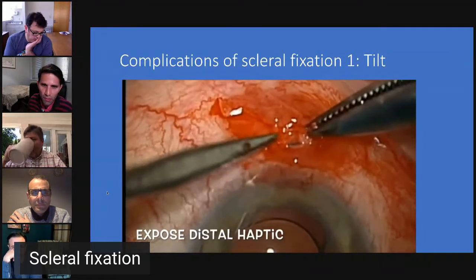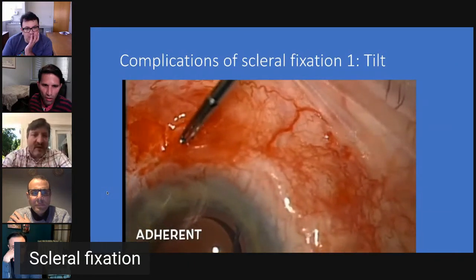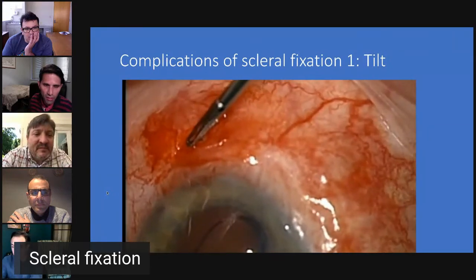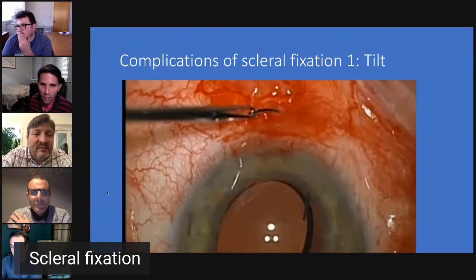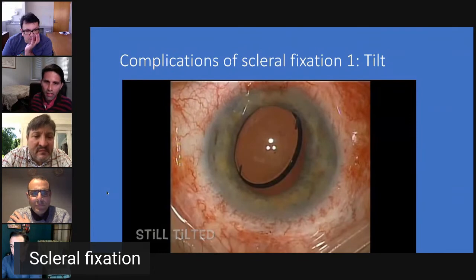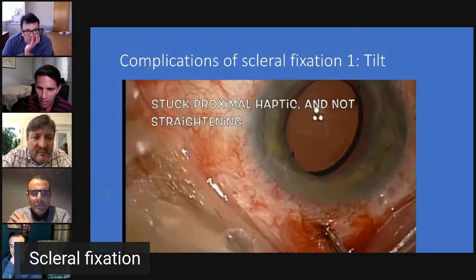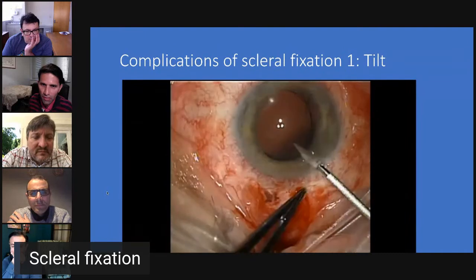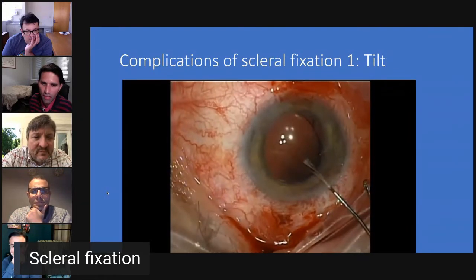Here we exposed the haptic. And I thought that if I just pull that haptic through a bit, it'll be perfect. But it's firstly adherent, which is the point of the tunnel. Finally managed to move it through the intrascleral tunnel, still tilted, you see, and didn't get anywhere. Then I opened up the other haptic, tried to pull that through, still tilted. And I thought, well, maybe if I make an incision in the cornea and then rotate it manually, that'll do it.